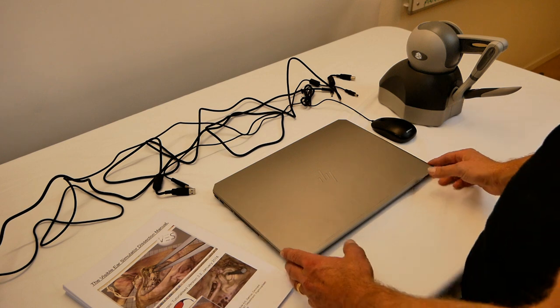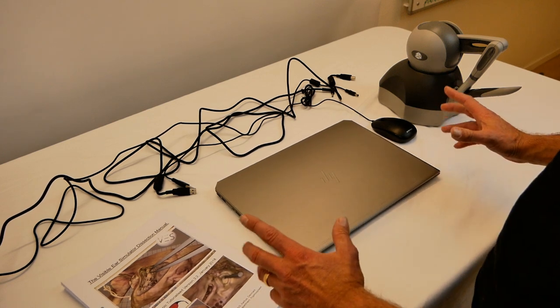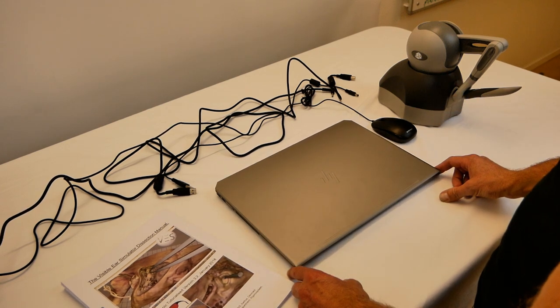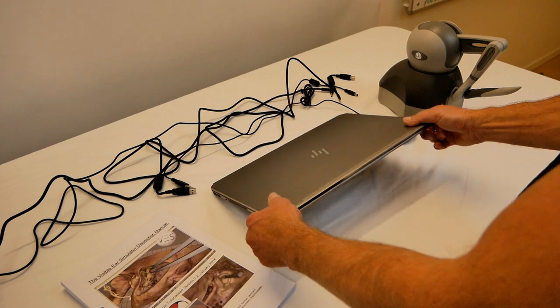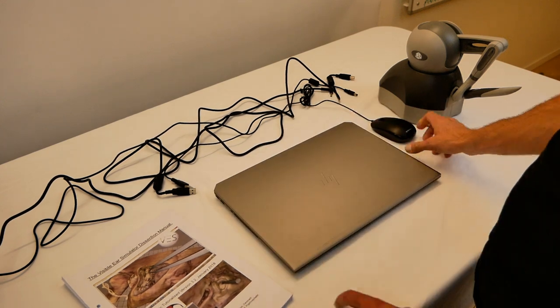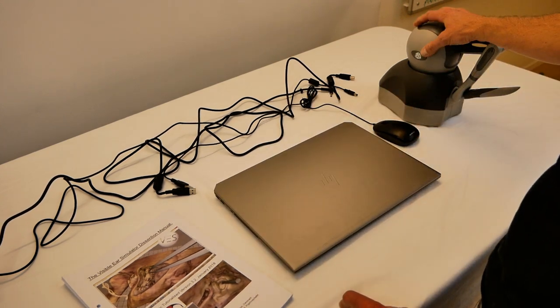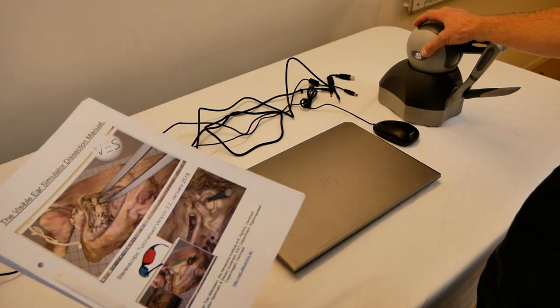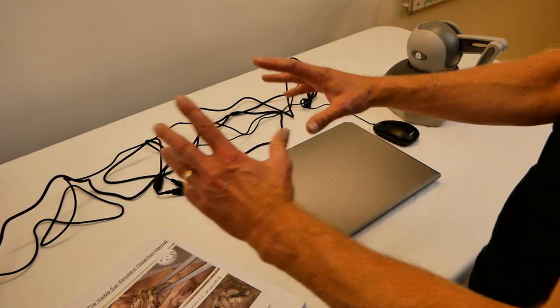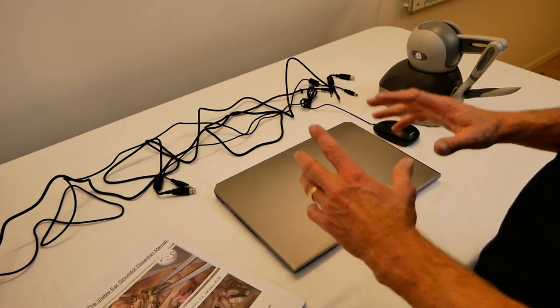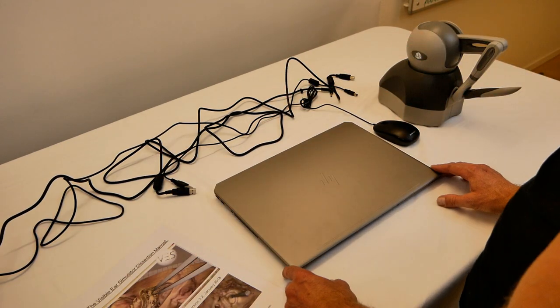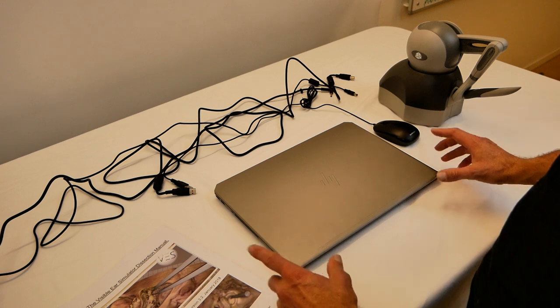Okay, we have everything unpacked and placed on the table. We have everything we need: the computer, a mouse, the haptic device, the manual, as well as all the connectors. It's very simple to get started.